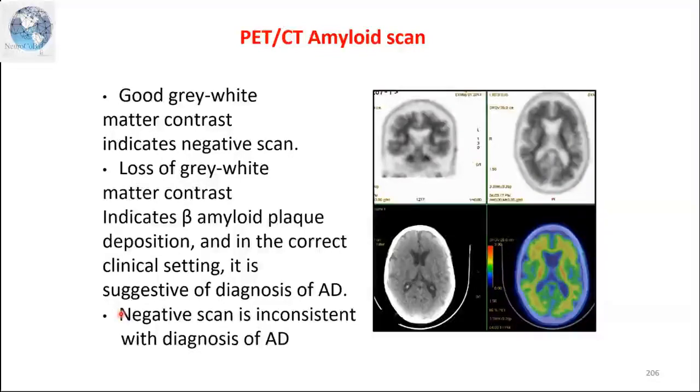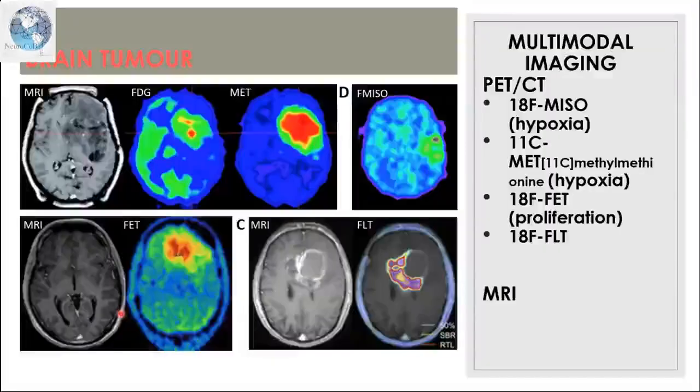And then we go to amyloid scans. Okay, Dr. Kamalia mentioned it is more specific. It's looking at amyloid deposition in the brain. So that can be more specific to Alzheimer's, depending on the clinical findings and also which areas it is distributed. Okay, because there are some other dementias that can also have amyloid angiopathy. That means ada juga pathology amyloid, tapi tak seketara Alzheimer's. Alzheimer's memang very high in the beta amyloid deposition.